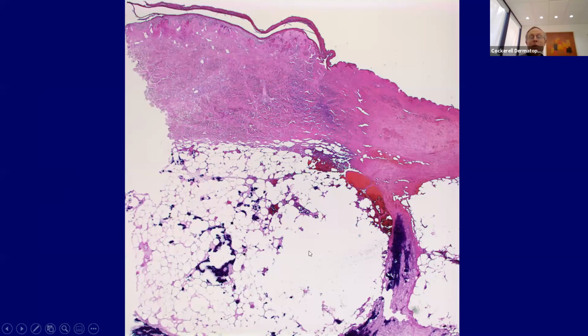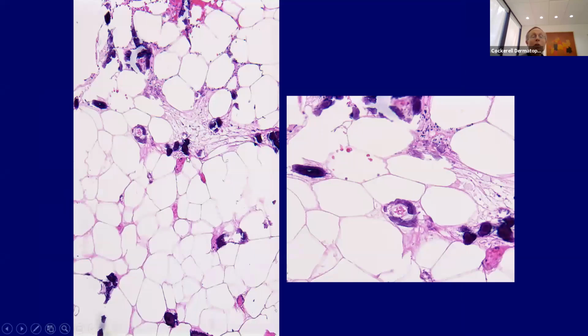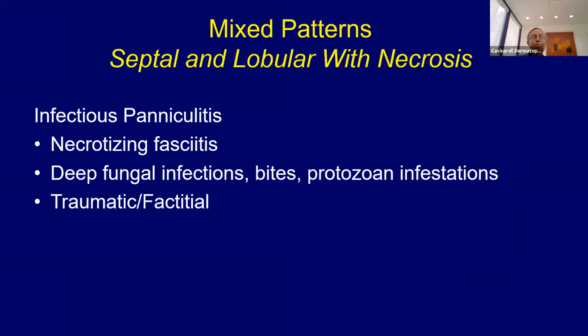But all of this calcification, subcutaneous fat here, calcification, these larger blood vessels over here, and then with a higher magnification, even the blood vessels that aren't calcified are thrombosed here. So this is a lobular panniculitis without much inflammation, but it's basically dying because of the ischemic necrosis that's occurring secondary to, in this case, all of these small blood vessels that are thrombosed with or without calcification. So sometimes if you get an early lesion of this, you'll just see these blood vessels here that are thrombosed without much calcification. Sometimes the calcification is really subtle. So you may need to take more than one biopsy, especially if you're getting an early lesion. If you get a late lesion like this, it's obviously pretty simple to diagnose, but when you get an early lesion it's going to be more challenging.